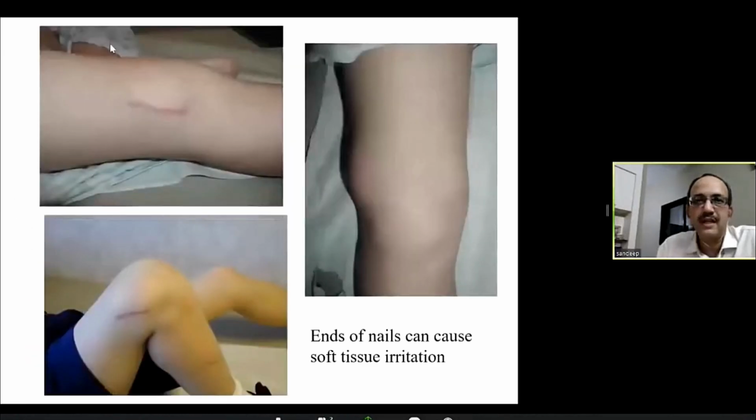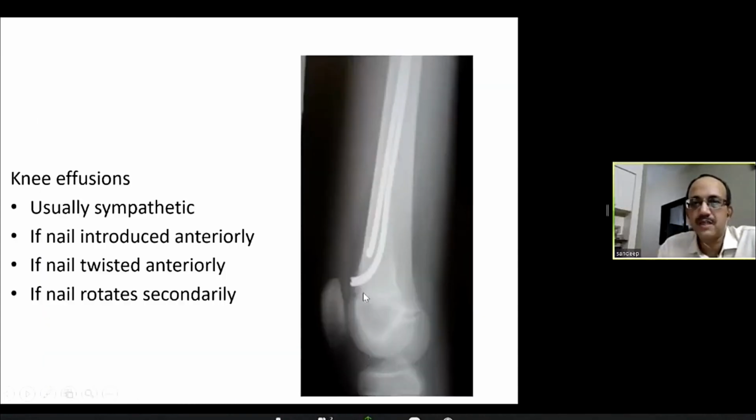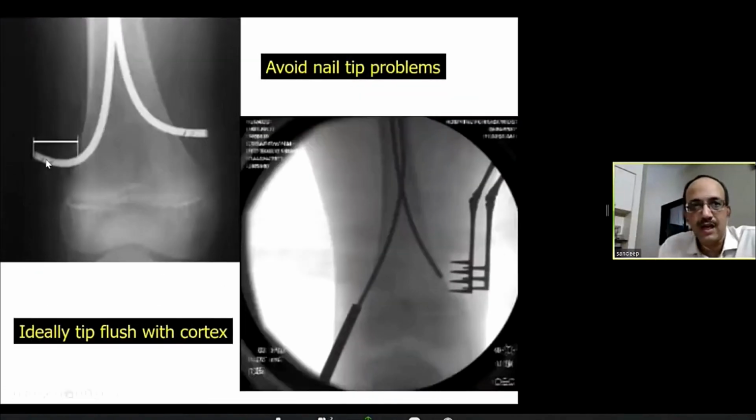if you don't seat the nails flush, you get recurrent effusions like these. The end of the nail can cause soft tissue irritation, especially if the nail is pointing anteriorly or if it rotates anteriorly secondarily. So a right angle bend of the nail is a very bad idea. You should have the nail flush with the cortex.